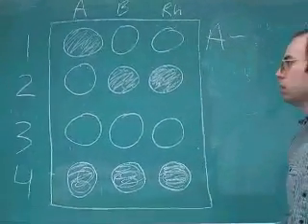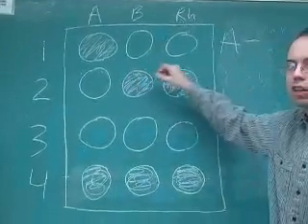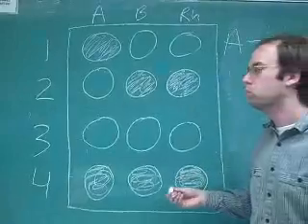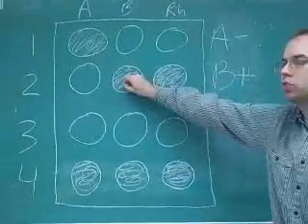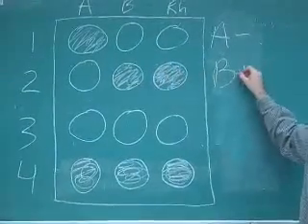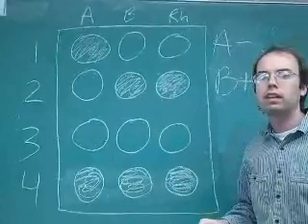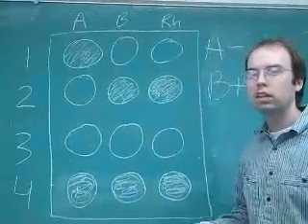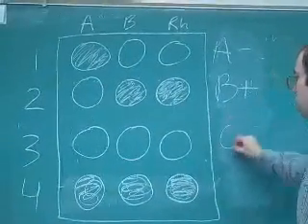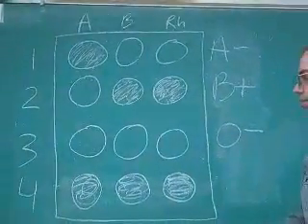There's no Rh factor. This particular person had B antigens and Rh antigens. So this particular person was B positive. B antigens plus Rh antigens made the person positive. This person had no clotting at all. That means that none of those 3 antigens were present. If none of 3 antigens were present, the person must be O. Of course, O negative because the person was lacking Rh antigens.